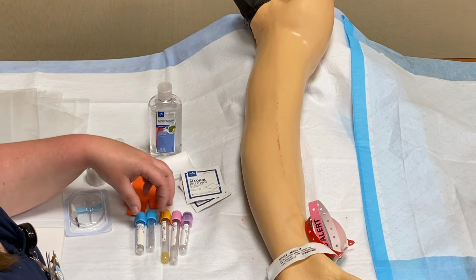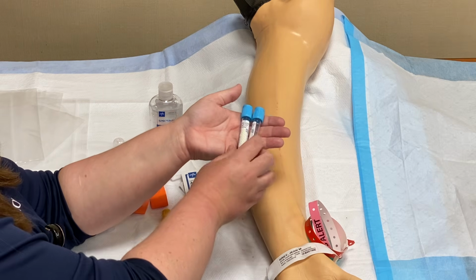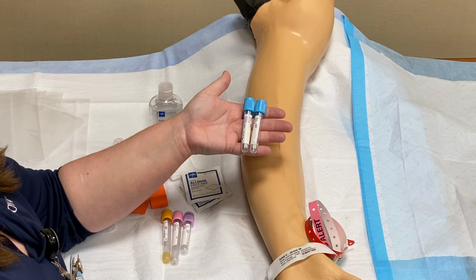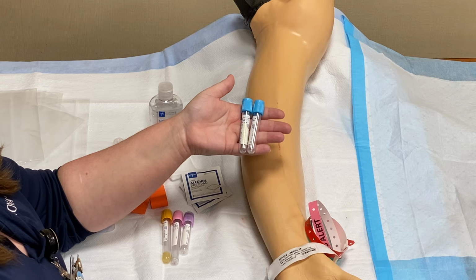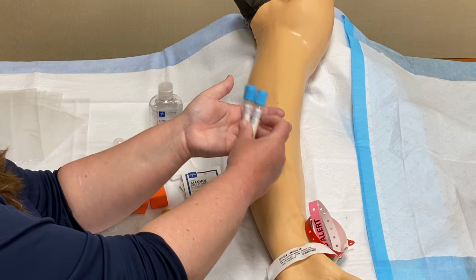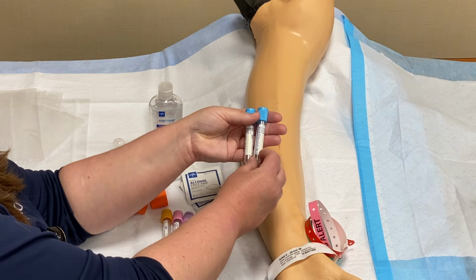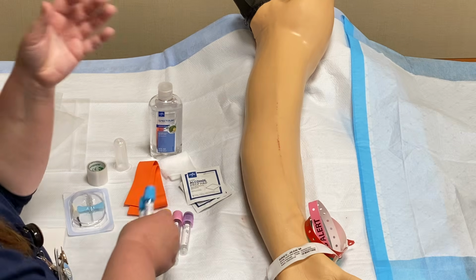I want to make sure that I get the correct tubes for the test that I've been asked to run. The nurse has said PT. The PT is to check for coagulation, and since this is a butterfly vacutainer needle, I need to make sure I have two blue tubes, one tube that I'm going to use as a waste tube, since the blue tube cannot have any air in it. And the max volume on my blue tube is 2.7 mLs.